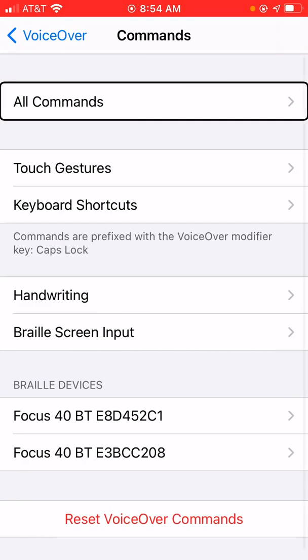There we go — Commands button found. Now, here in the Commands screen, we can customize anything, not just Braille commands. We can customize commands for when we have Bluetooth keyboards connected, set custom touchscreen gestures, etc. There's a lot we can do here. But towards the bottom of the screen, we have a Braille Devices heading, and under that a list of the Braille displays we've either currently or previously paired to the iPhone.